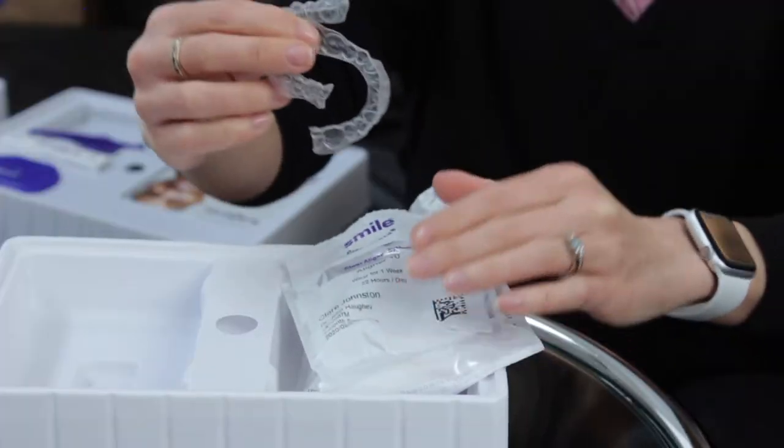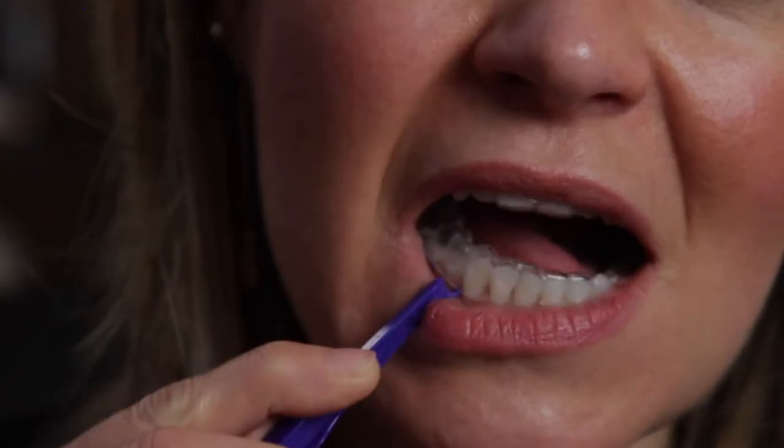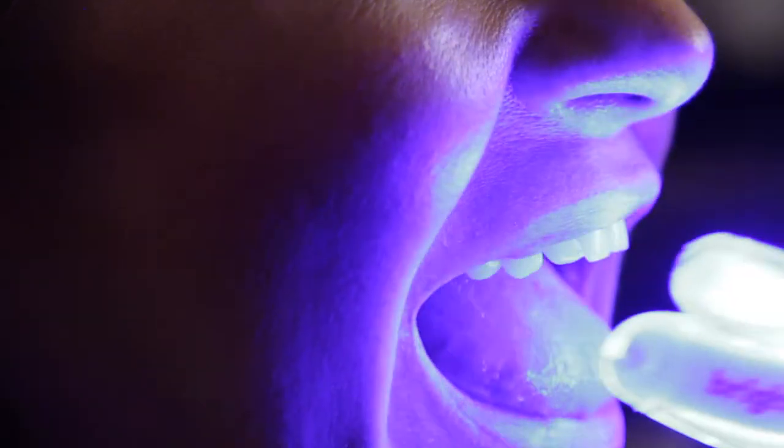Hi and welcome to another Honest Review. Back in March I shared a video right at the start of a four-month teeth straightening treatment with Smile Direct Club. Now unfortunately that four-month plan hasn't exactly gone to plan as you're about to see.